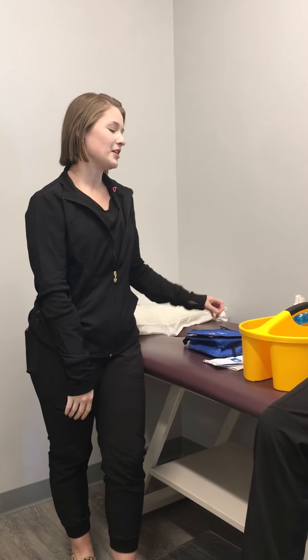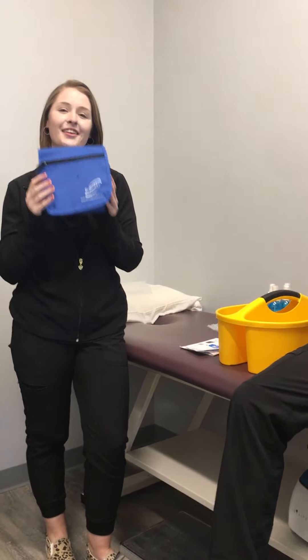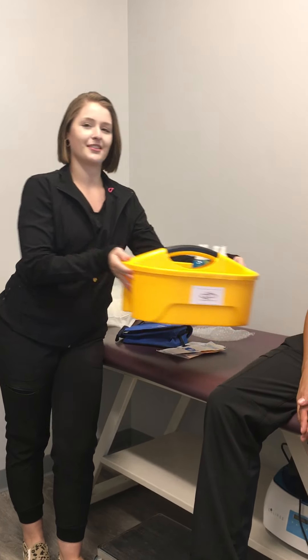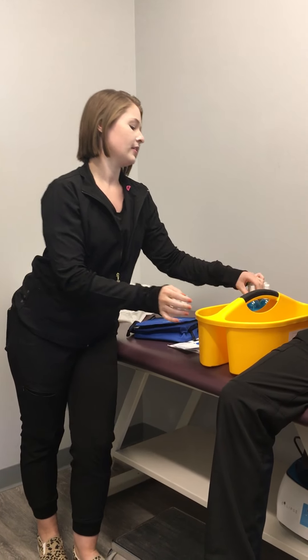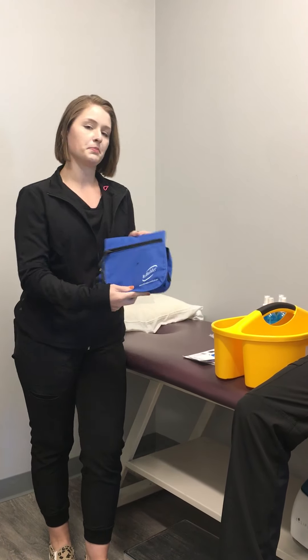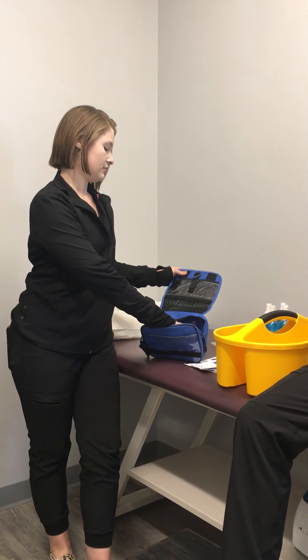Good afternoon North Texas patients. Today I am going to be explaining your Rebuilder kit that we will be sending you home with. You will get this nice yellow bucket, four bottles of electrolyte solution, and this glue pack which will have the Rebuilder unit.